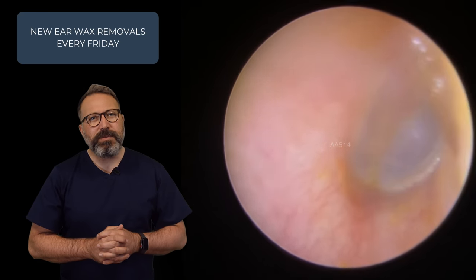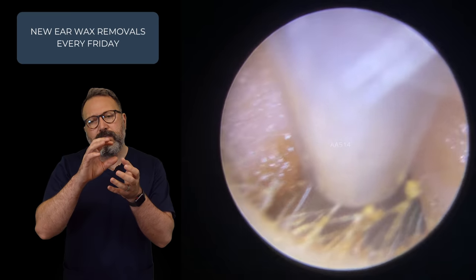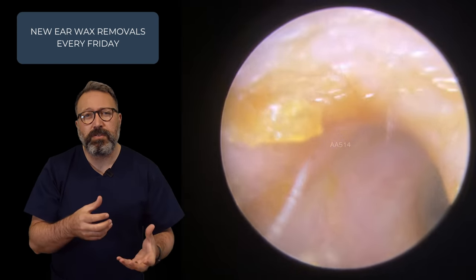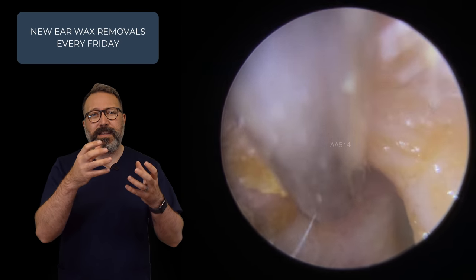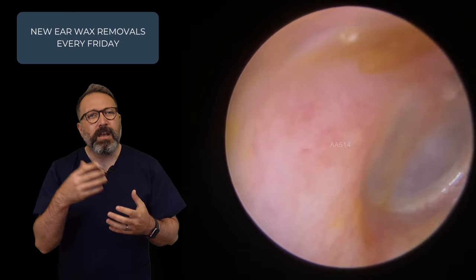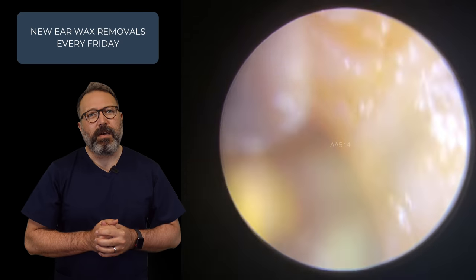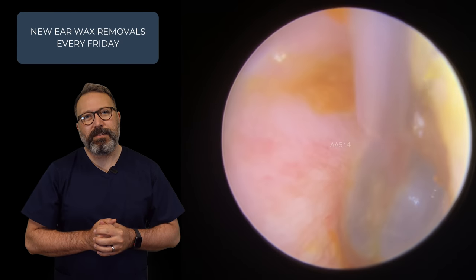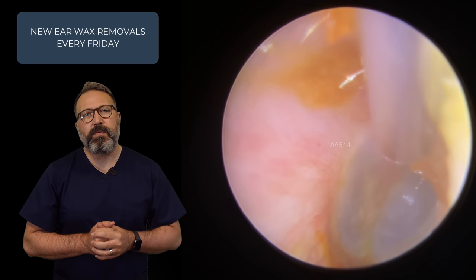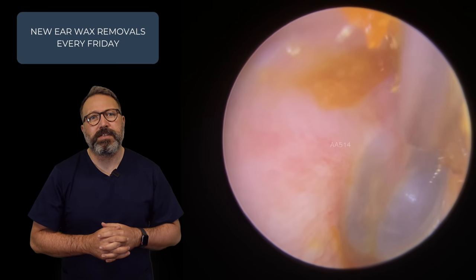Let's take a good look at that eardrum. Eardrum itself looks a little bit dull — there's not a fantastic light reflex there. This is quite common at this time of year when you get colder weather and colds start doing the rounds. Some people get this little bit of dullness to their eardrum, usually an indication that either the eardrum isn't sitting in its normal position, or there may be a little bit of fluid sitting behind there. We're just doing a little bit of tidying up — just spotted another little piece to the right-hand side, so we'll get rid of that. Just pop the fine end on there to work closer to the canal wall.